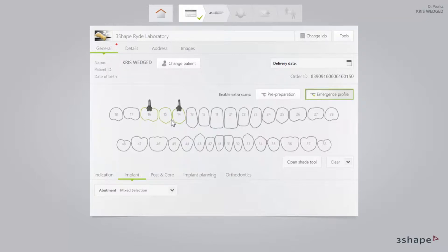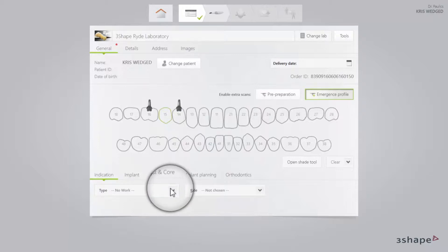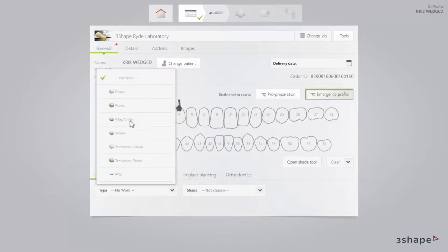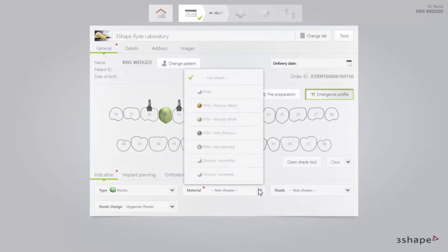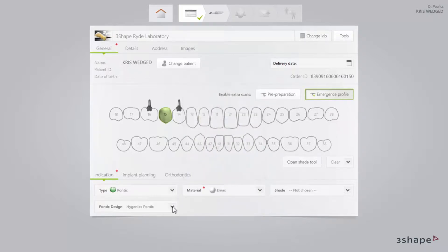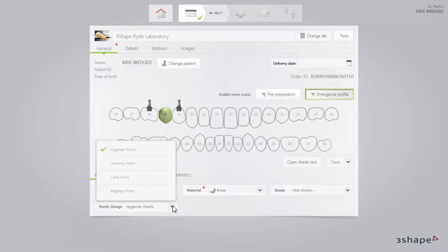Now select the tooth for the Pontic and deselect the abutments. In the Type drop-down list select Pontic, then Pontic Material, and in the Pontic Design drop-down list select the type of Pontic.